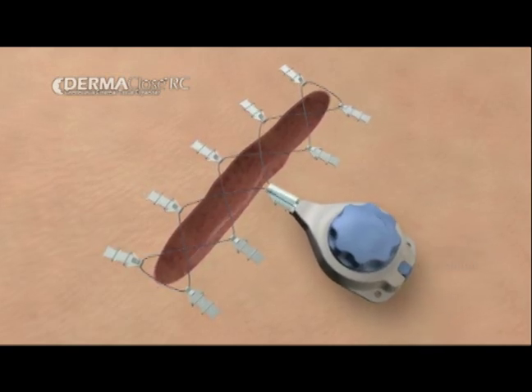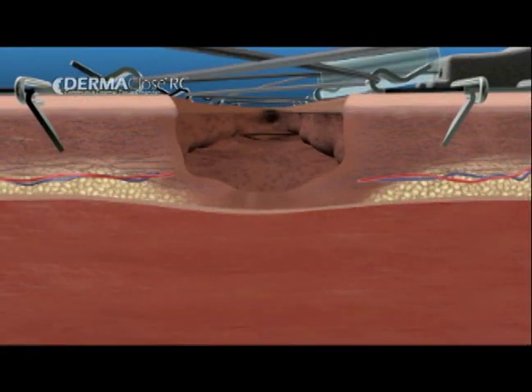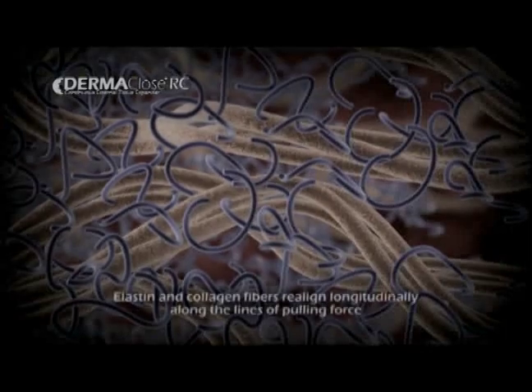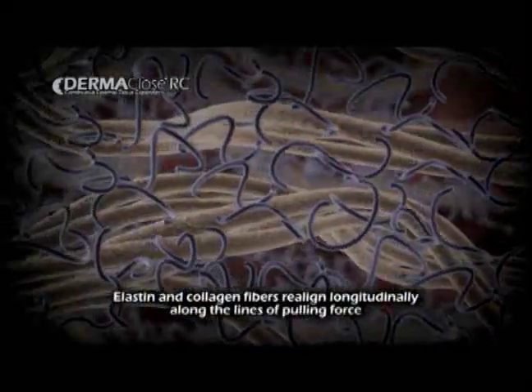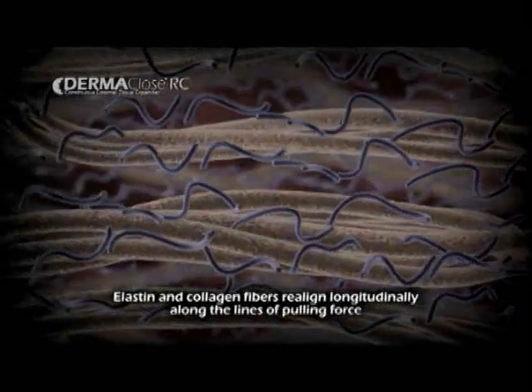Immediately, Dermaclose will begin to exert 1.2 kg of tension on the tissue adjacent to the wound. No additional tightening is required. The collagen and elastin bundles will begin to realign longitudinally, expanding the tissue to cover the wound.